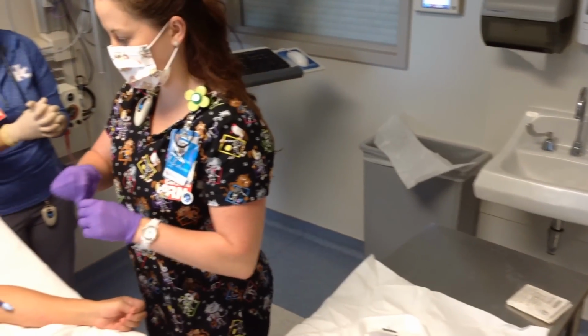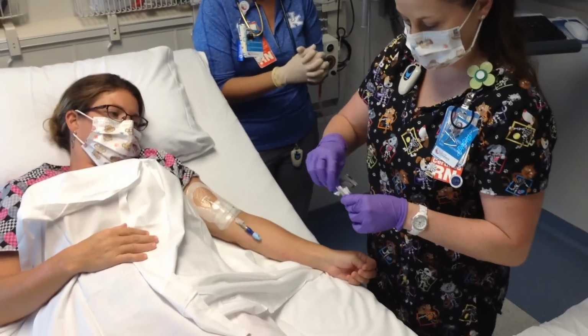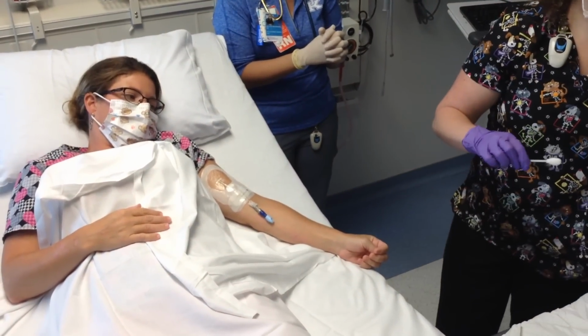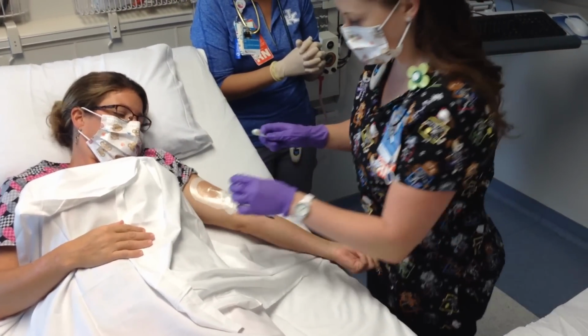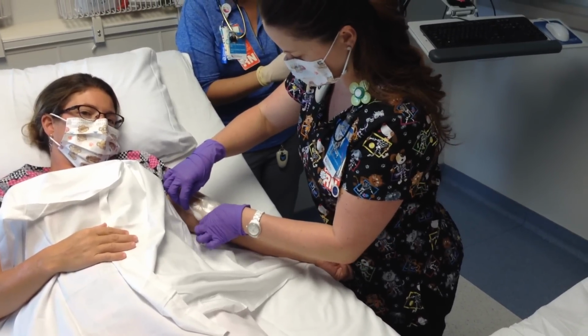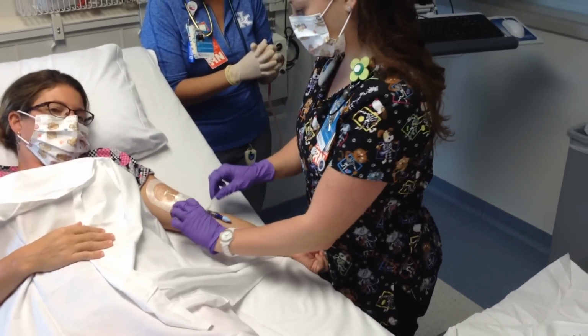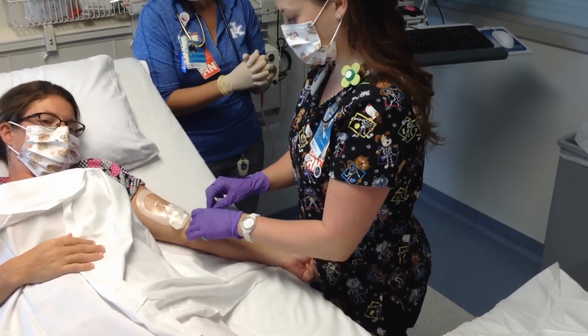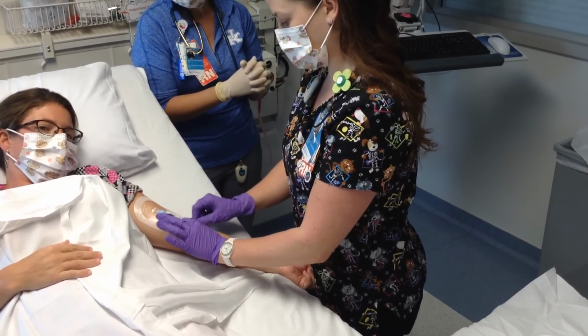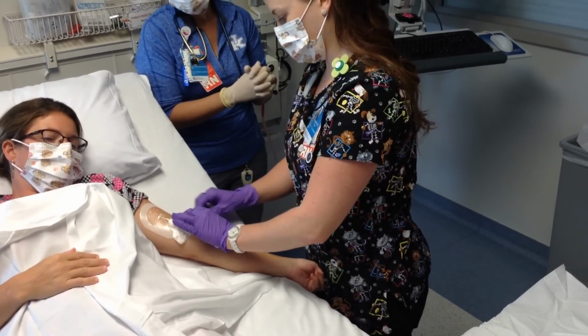Now we're going to remove our old dressing. With your current gloves, remove the old dressing and securement device. Your gloves are no longer sterile, but since sterile gloves are not required, proceed with removing the patient's old dressing. You want to utilize sterile saline swabs and ChloraPrep sticks to aid in the removal of the dressing.